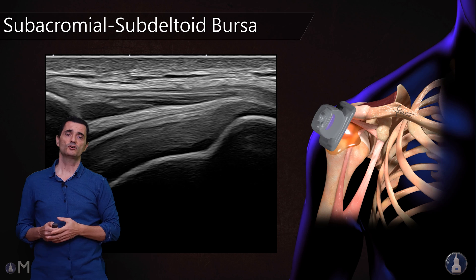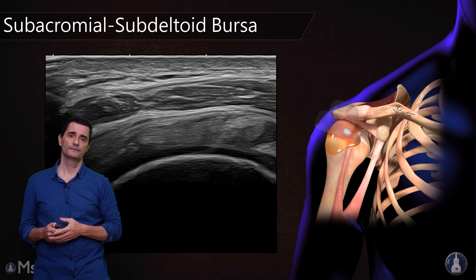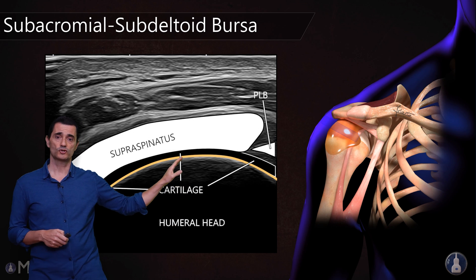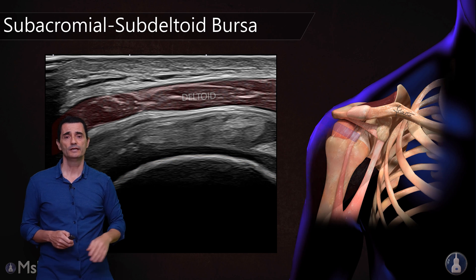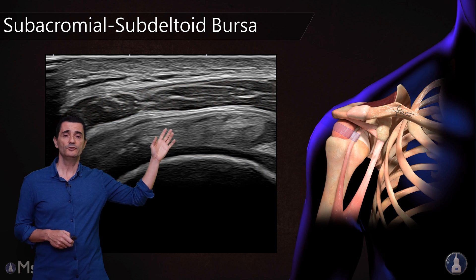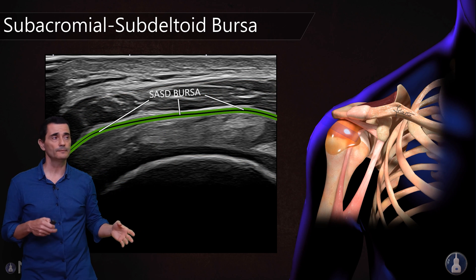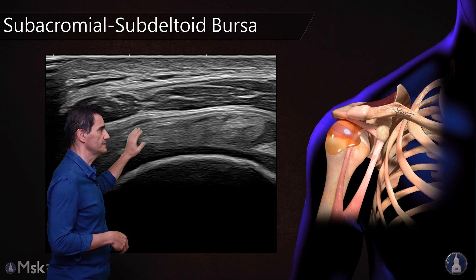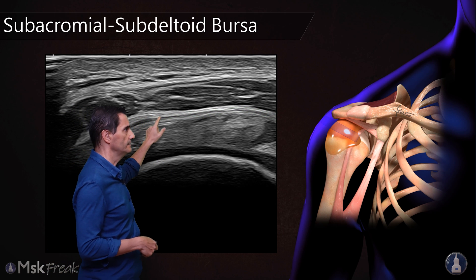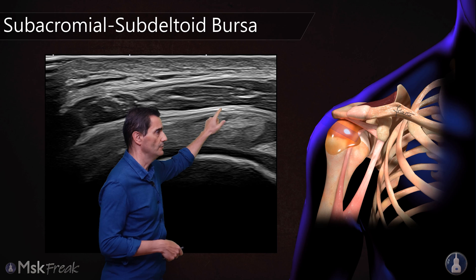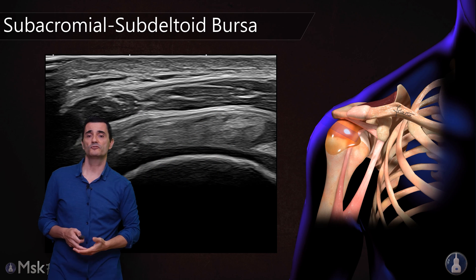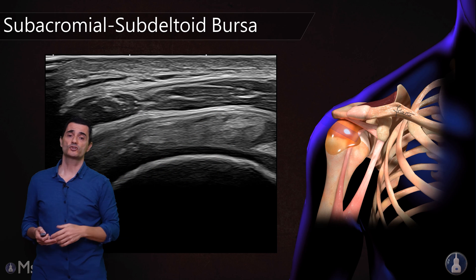In the short axis, this will be the supraspinatus on its short axis and this will be the deltoid on its short axis. This double hyperechoic line you can see here with this thin anechoic line just between the hyperechoic lines. This is the normal bursa on its short axis.